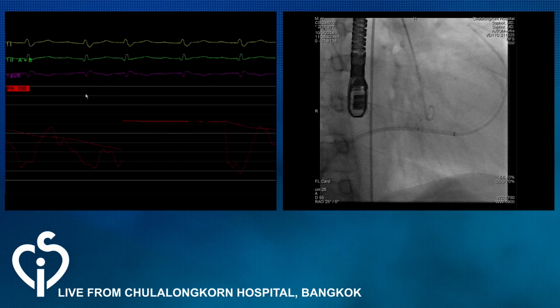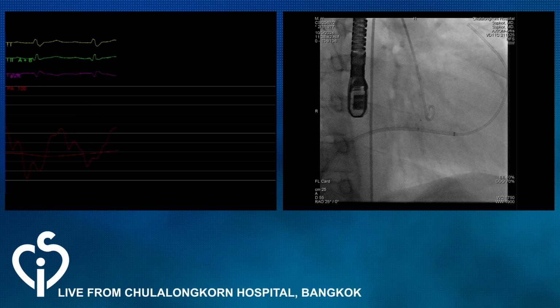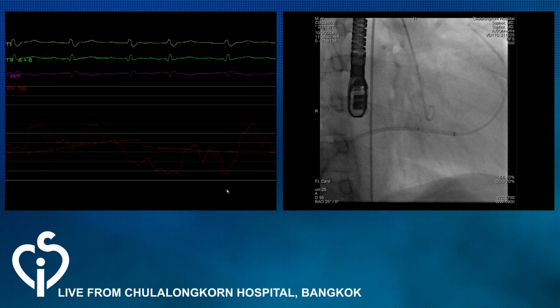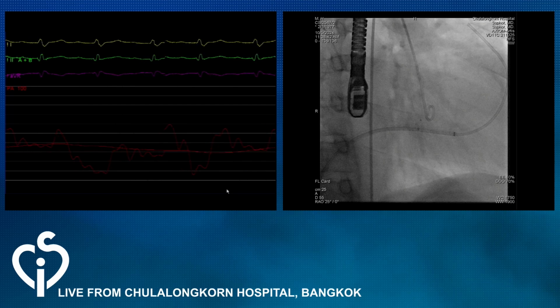Okay, this is the PA pressure. What range is it? The patient is on sedation and has some secretion because we did not do general anesthesia. Okay. What sort of reading are you getting, because we can't see any? Is there some leak over there?